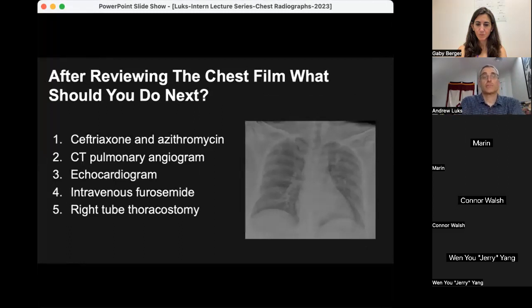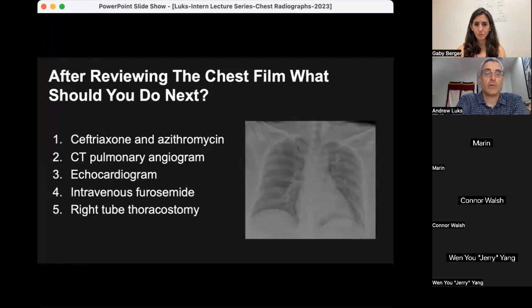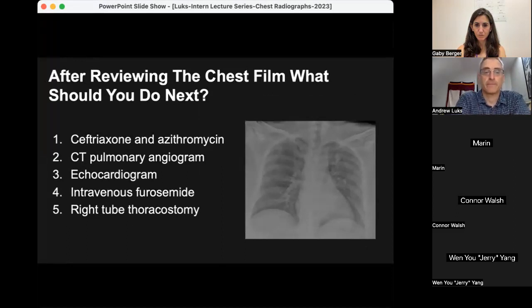After reviewing the film, what should you do next? Should you start this patient on ceftriaxone and azithromycin? Should you obtain a CT pulmonary angiogram? Should you obtain an echocardiogram? Should you start furosemide? Or should you do a right chest tube placement?